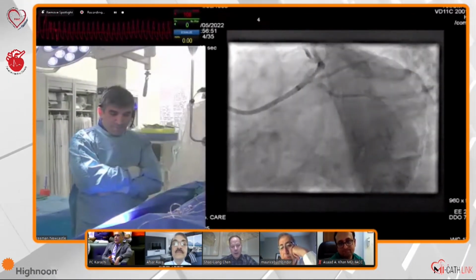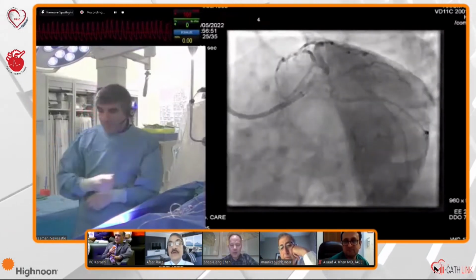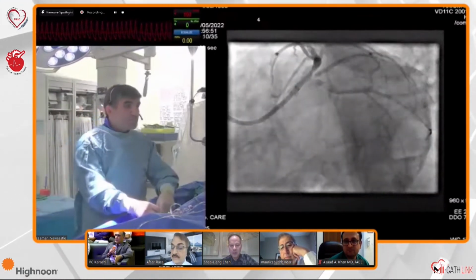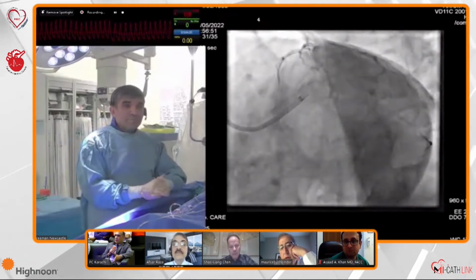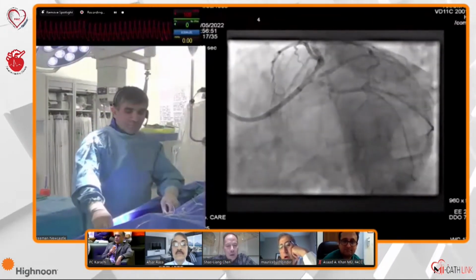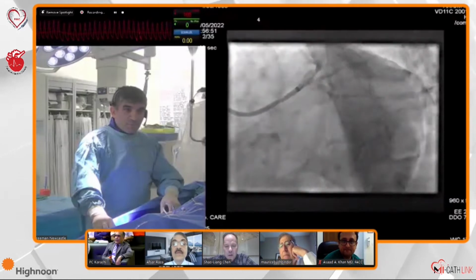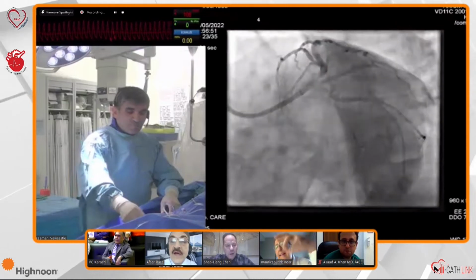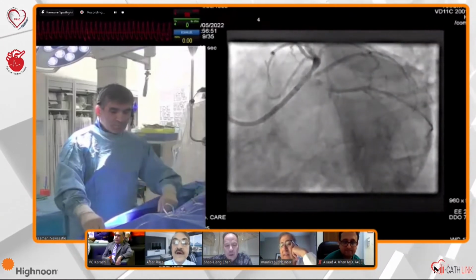Okay. Yep. My only concern is that, maybe not a very high risk, but if you just rota the LAD first and the circ closes down, then what? Because you only have one wire when you're rotating, unless you want to do a rota and keep a wire in the circumflex. Or you could first dilate the circ and OM, and then take it out and create the left main LAD. At the end of the day, he has to live with the left main and the LAD. That's most important.